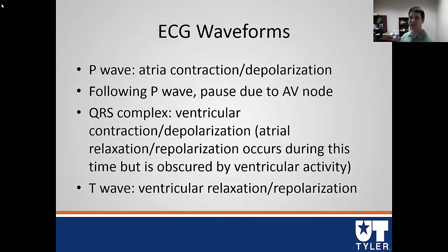So in an ECG tracing, we're going to have several working parts, and I'll give you the definition here, and then we'll move into a diagram and we'll walk through each of these. So first is, as you can imagine, what an ECG is going to do is it's going to measure electrical current. Okay? So as ions move in depolarization form for a muscle contraction, they are measurable by looking at the electroactivity. So when sodium ions come rushing into the cell, those ions work just like electricity. We can put on monitors in order to be able to monitor that electricity and see what they look like. So in general, when we use an ECG, we're measuring waveforms.